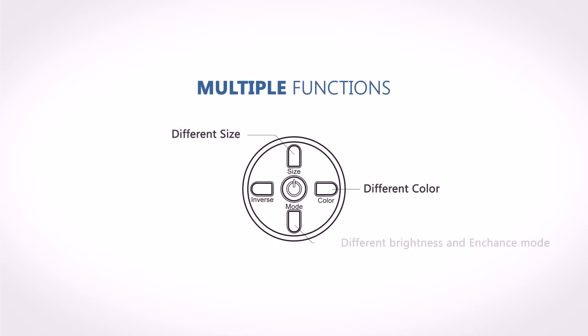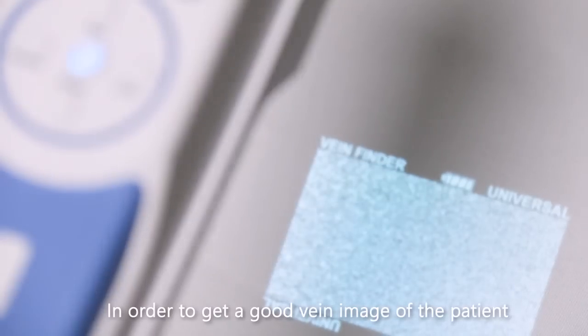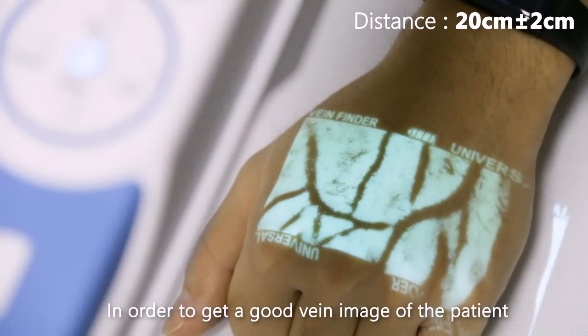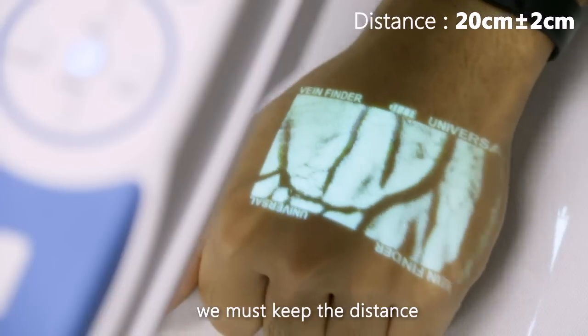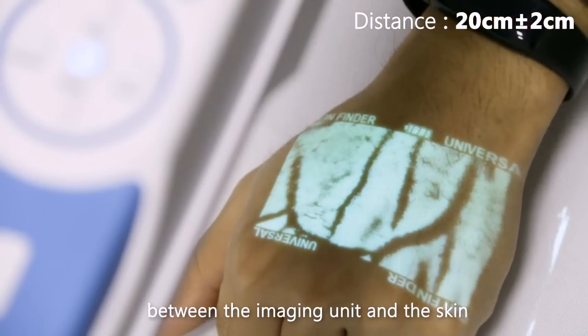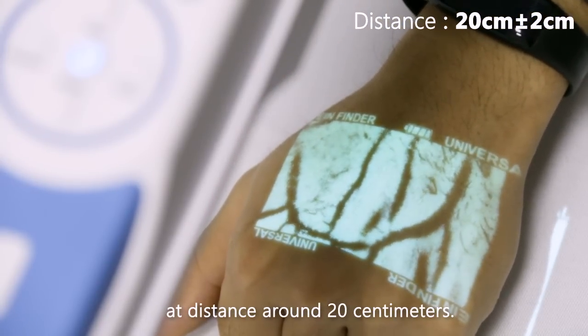VS 400 has multiple functions with different colors, different sizes, different display modes, and inverse mode. To get a good vein image of the patient, keep the distance between the imaging unit and the skin at around 20 centimeters.